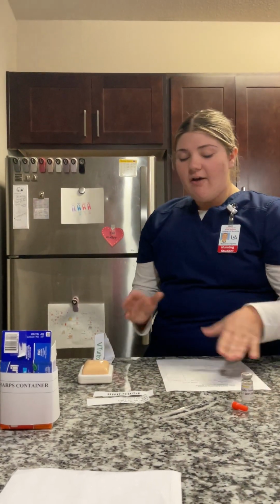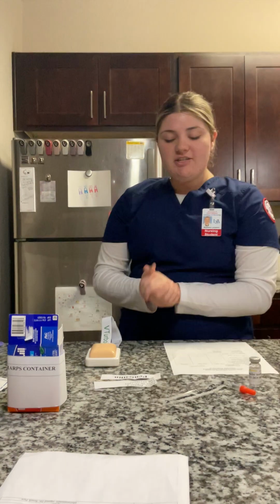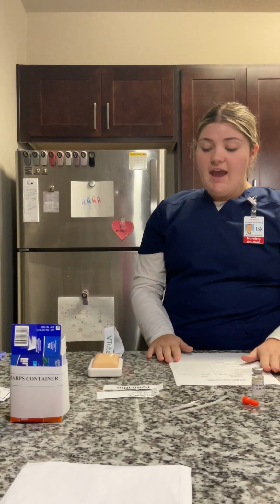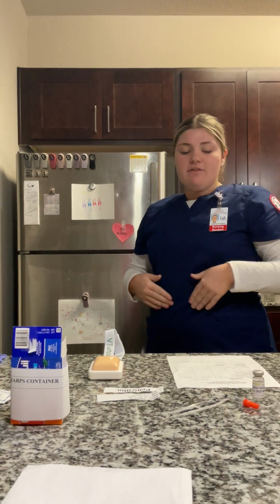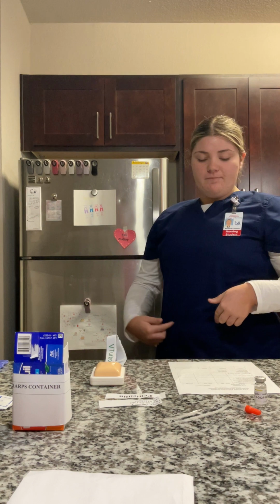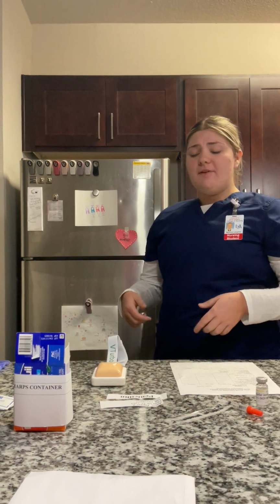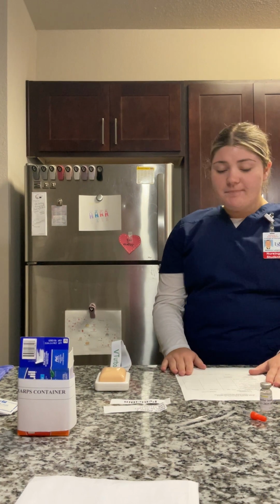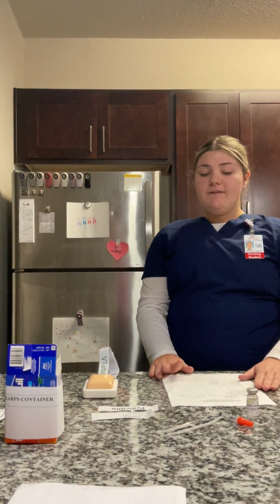And now I will let Mr. Jones know that today I will be injecting him with insulin, and I checked his blood sugar levels, and he is all good to get it. And I'm going to be doing this in the subcutaneous site, which is the abdominal injection site, about right here. And I'll be doing it at a 45 or 90 degree angle, depending on the amount of skin he has for me to pinch.